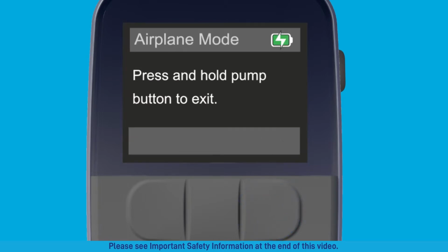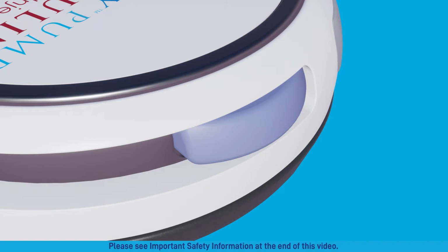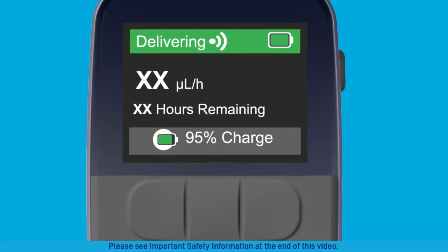The pump will continue to deliver medication even when the remote is in airplane mode. When you're ready to exit airplane mode, press and hold the pump button until you hear the 3-tone sound. Verify that your remote displays delivering on its home screen.